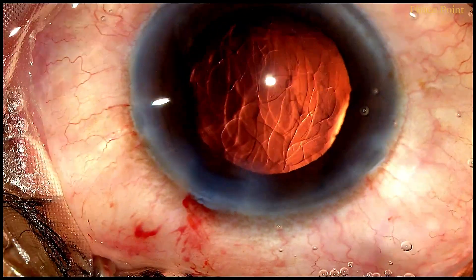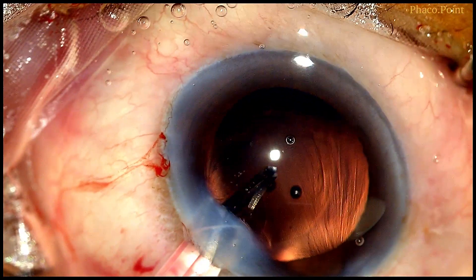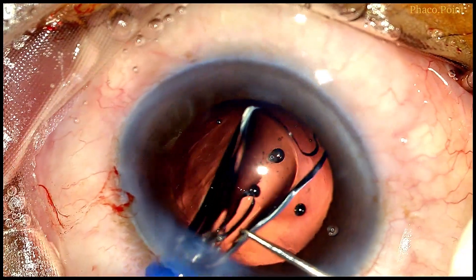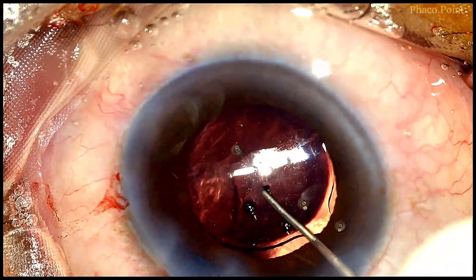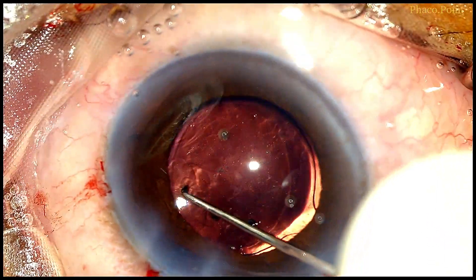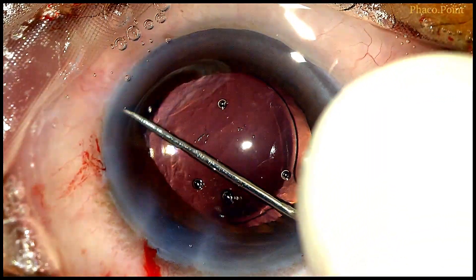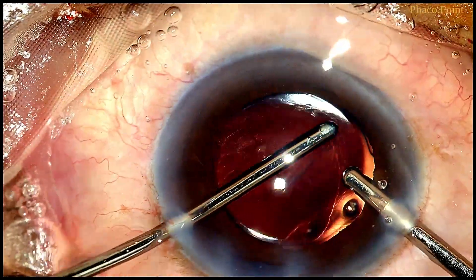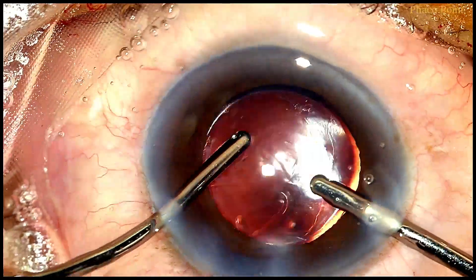We perform a viscofluid exchange at the end of irrigation-aspiration and are now ready to inject the single-piece monofocal IOL within the capsular bag. Other than avoiding major manoeuvring within the capsular bag, IOL implantation in a polar cataract case is not very different from any other cataract. The IOL is rotated to achieve a horizontal orientation of its haptics. With the IOL in the bag, note the horizontal diameter of the rhexis — it's clear that even if we had to place a three-piece IOL in the ciliary sulcus, there is adequate support provided by this oval rhexis.